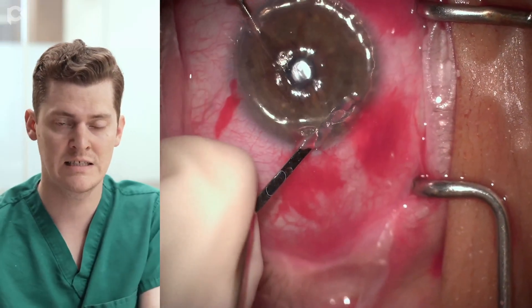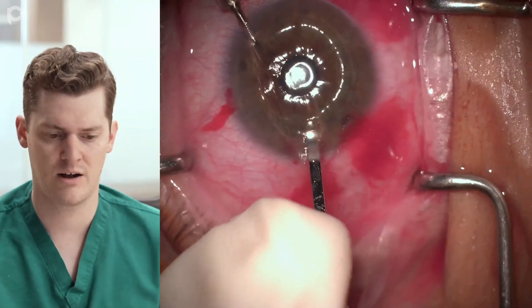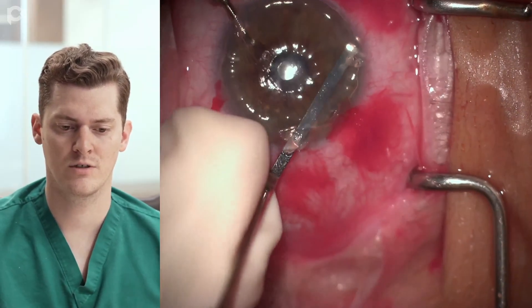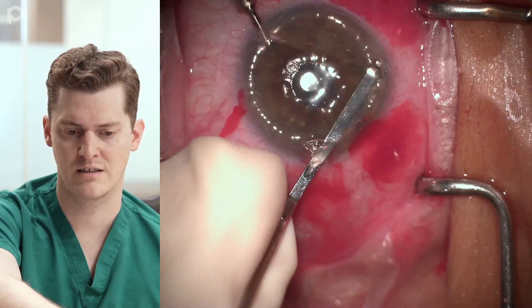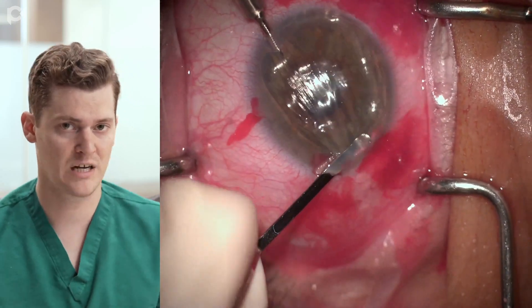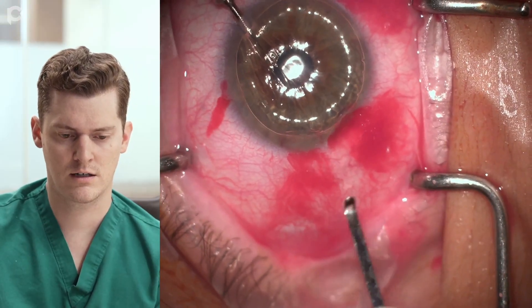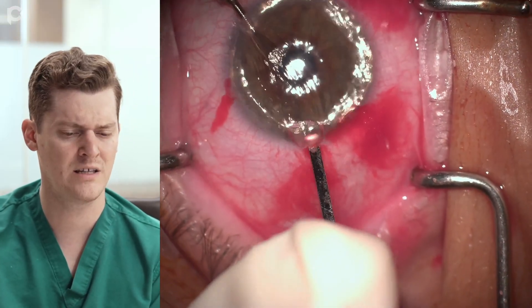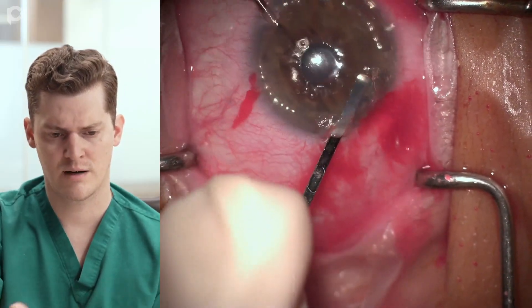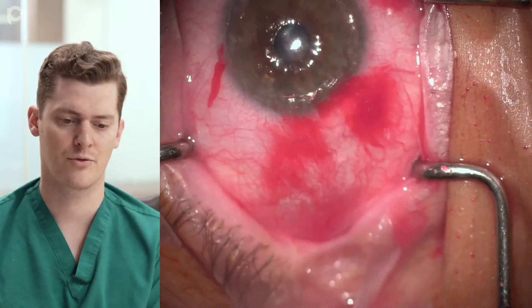If I pull fragments directly toward the wound, they often get crowded into the angle and become even harder to see. So I pull things centrally, going in with the reverse Sinski hook — instead of teasing, just pushing in gentle motions to push the fragments centrally so I can grab them with the scraper and pull them out. Fewer motions, less teasing, just getting things centrally for easier removal. I'm removing a few pieces here to make the landing zone bigger and more peripheral for when I'm unfolding the graft.